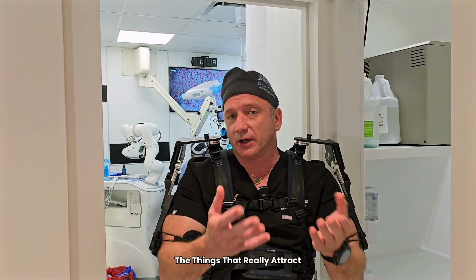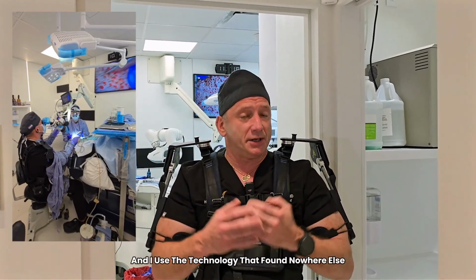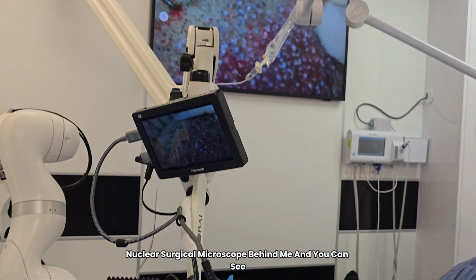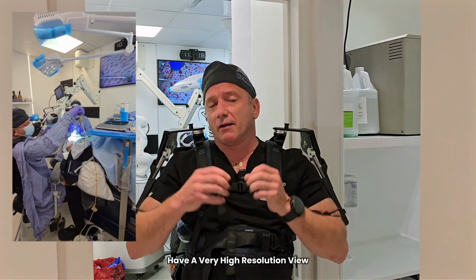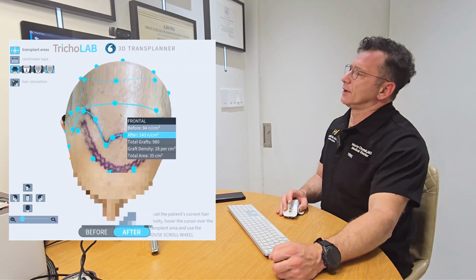The things that really attract physicians is the fact that I'm hands-on from the beginning till the end, and I use technology that you can't find anywhere else. For example, this neurosurgical microscope behind me, and you can see on the big screen the collecting of the graft. I use it to have a very high resolution view, 20 times magnification, and it also helps me to work very comfortably.